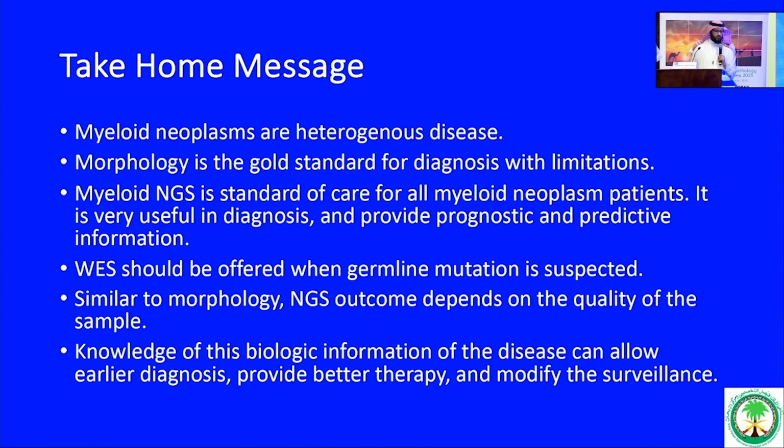Similar to morphology, NGS depends on the quality of the samples. Knowledge of biological information about the tumor is very critical in understanding how the tumor behaves and deciding the targeted therapy.